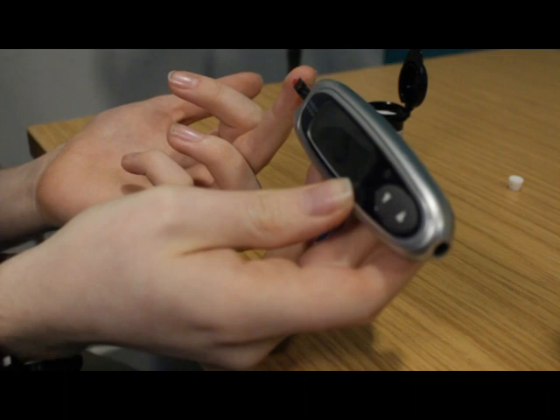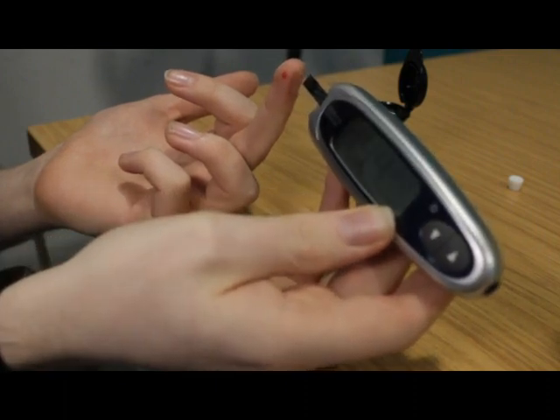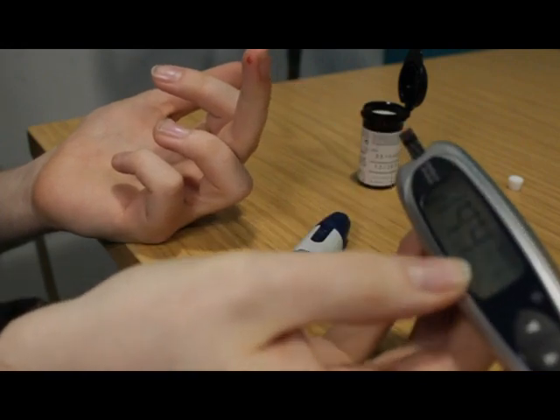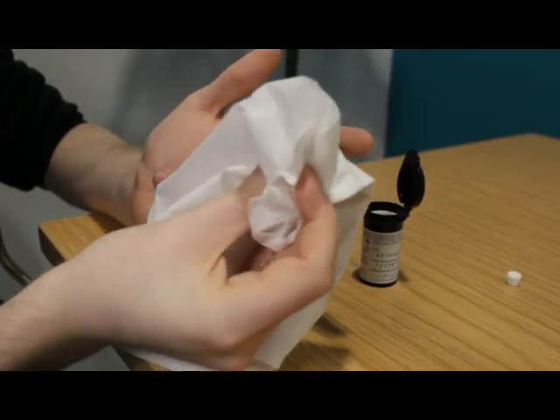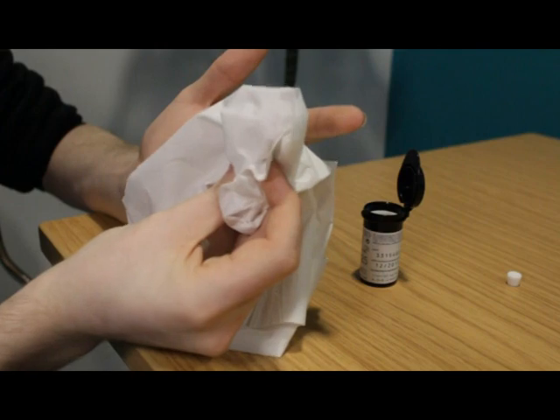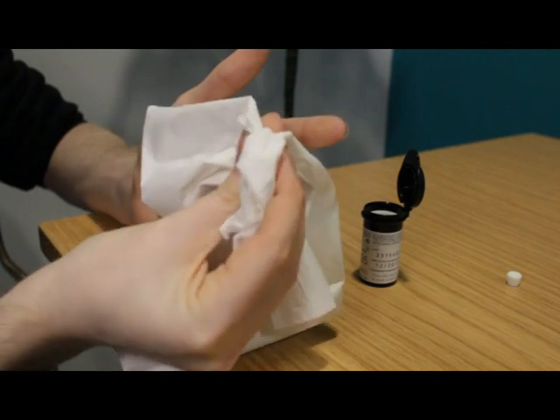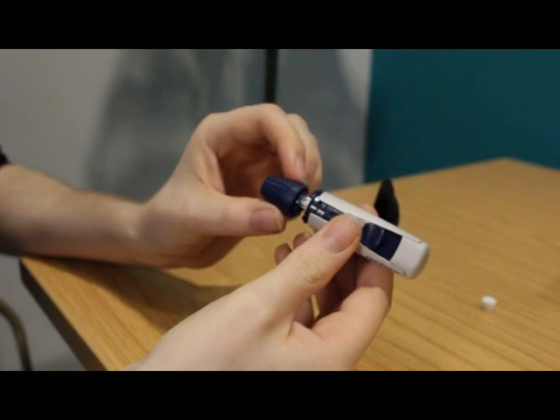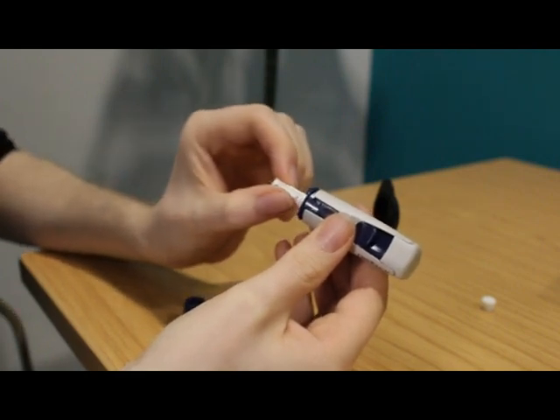After the puncture, hold the tip of the test strip in the drop of blood until the meter tells you the test strip is filled, usually by bleeping. Remove the test strip from the blood. Wipe the puncture site with a clean dry tissue and hold pressure on the puncture site until the bleeding stops. Remove the end cap from the lancing device and remove the used lancet and dispose of safely, such as putting it into a sharps bin.